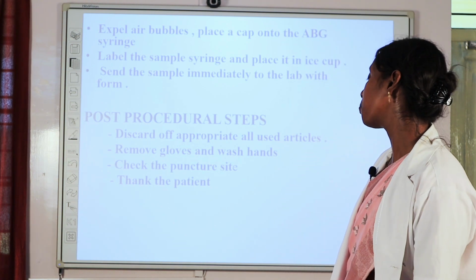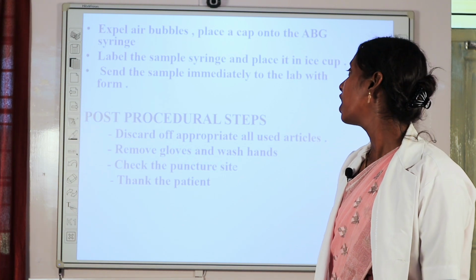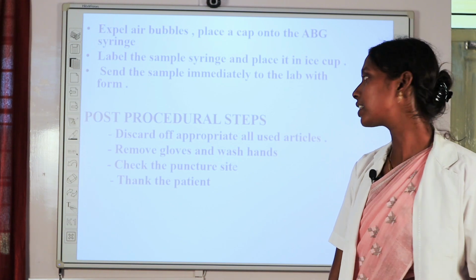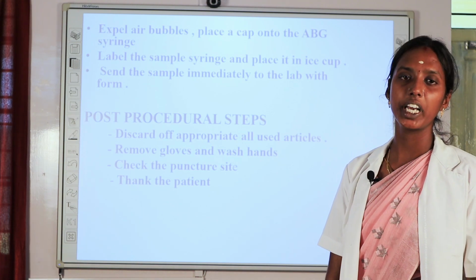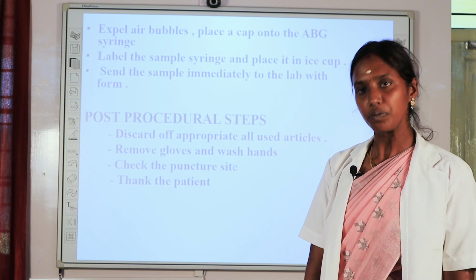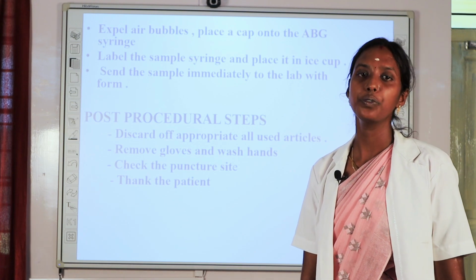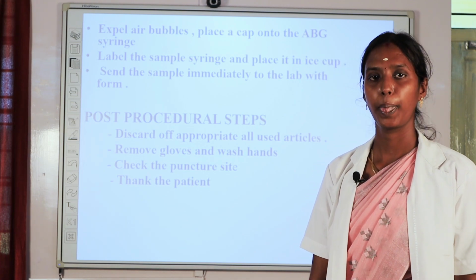And the post-procedural steps we will do are: discard all the articles, remove gloves and wash hands, and check the puncture site for any bleeding or thrombosis, or any other complications, and thank the patient for the cooperation.